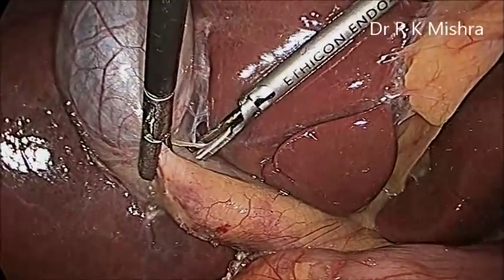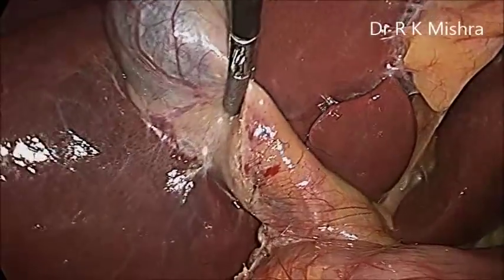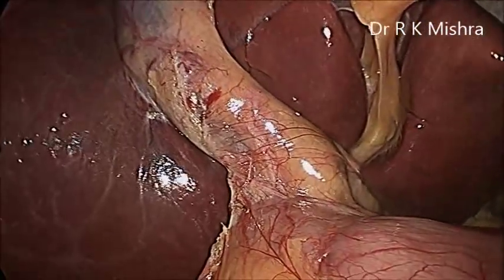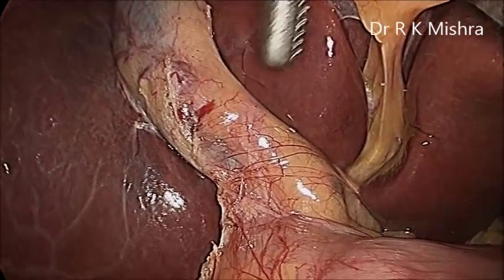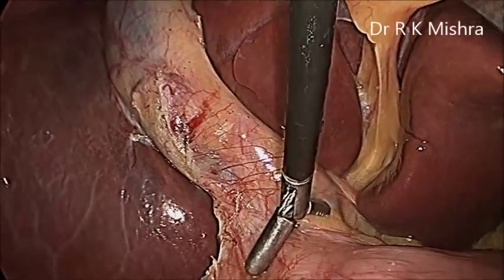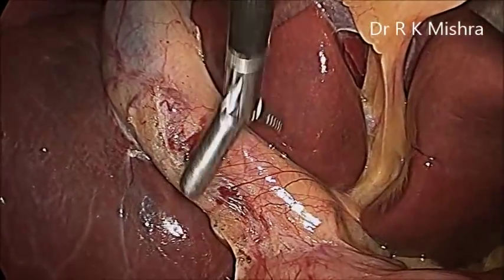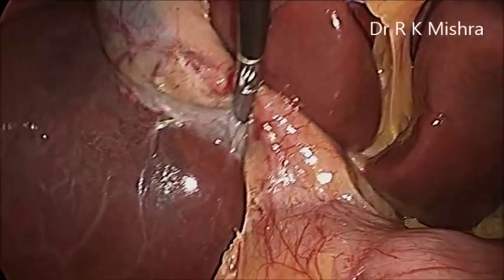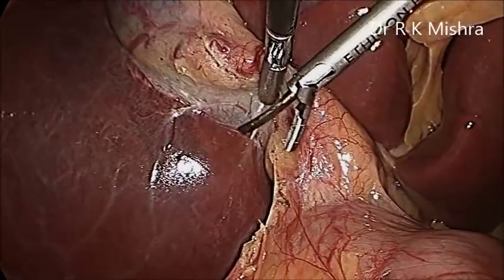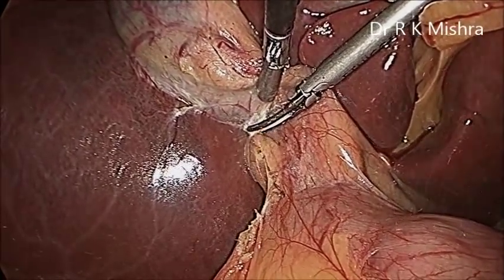Now this is the anterior surface. A little more traction was given to the fundus. Now with the atraumatic grasper we are trying to feel for any stone there. There was no stone, but it was a little dilated, so we are trying to feel if there is any stone. Then you can do milking of that stone towards the fundus.